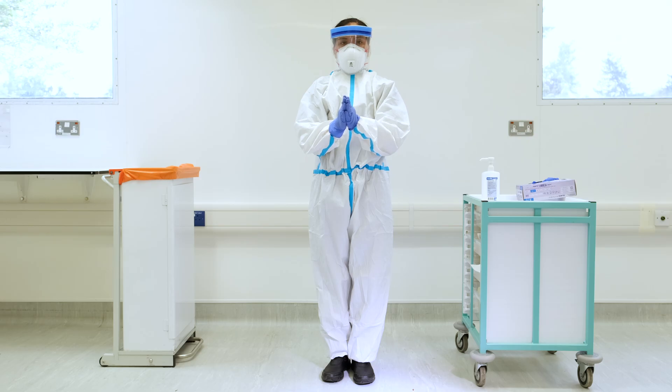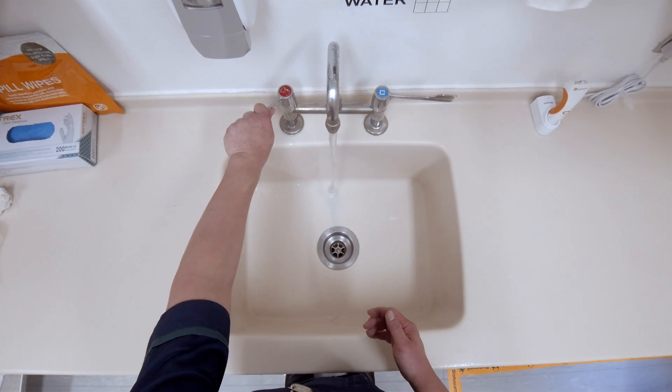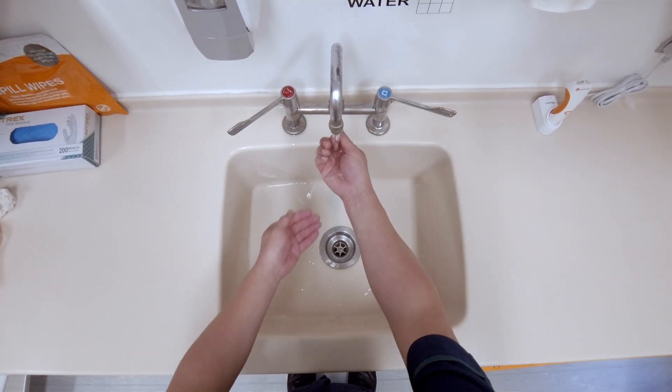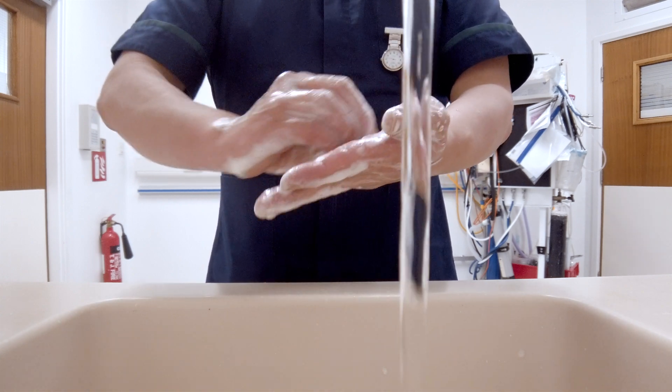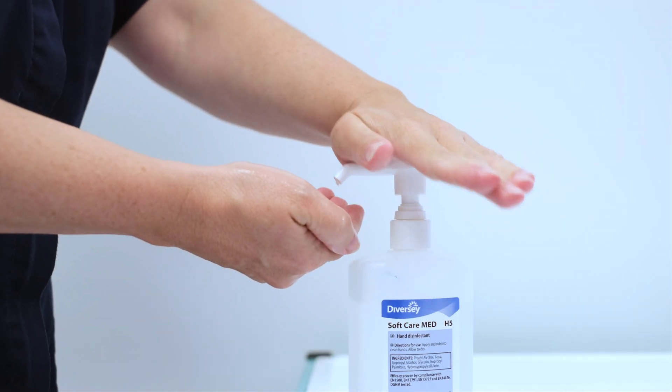In the next scenario, the healthcare worker will be using a coverall. Perform hand hygiene before donning personal protective equipment. Ensure that you are bare below the elbows and wash your hands with soap and water, or use an alcohol-based hand rub.